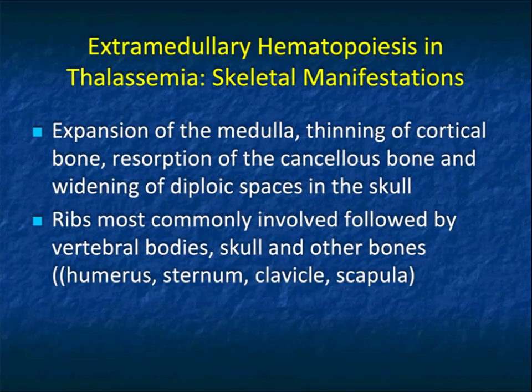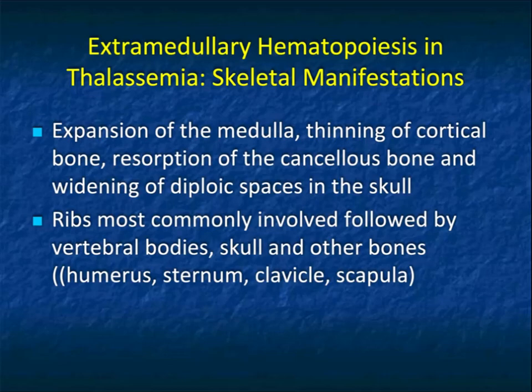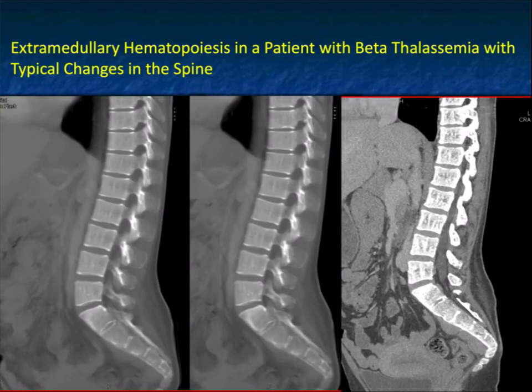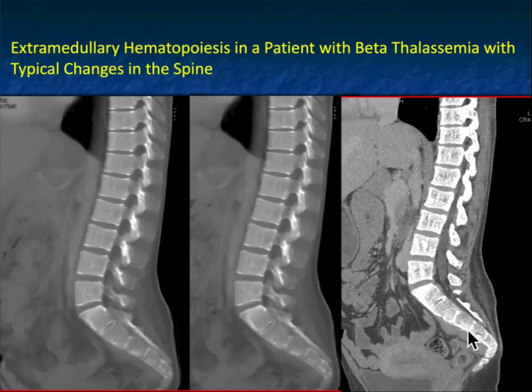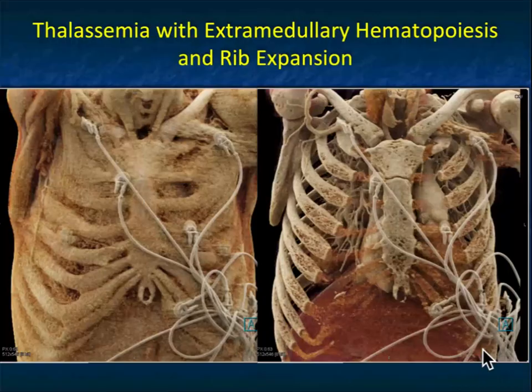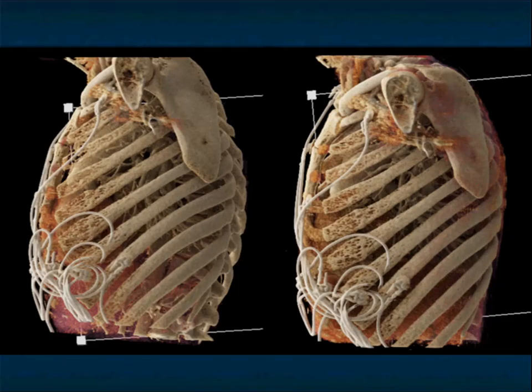In terms of skeletal manifestations, what you're visualizing is expansion of the medulla, thinning of the cortical bone, and resorption of the cancellous bone with widening of the diploic spaces in the skull. The ribs are most commonly involved, followed by vertebral bodies, skull, and other bones. In a patient with beta thalassemia, you can see coarse changes in the spine and coarse trabeculations. At L4-5, extramedullary hematopoiesis is nicely shown, looking like nodes. You also see it in the sacrum, with rib expansion and sternal involvement best shown on texture mapping.